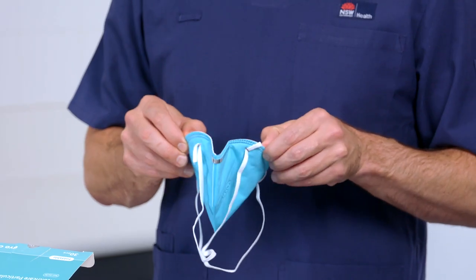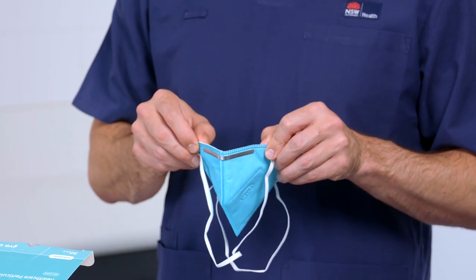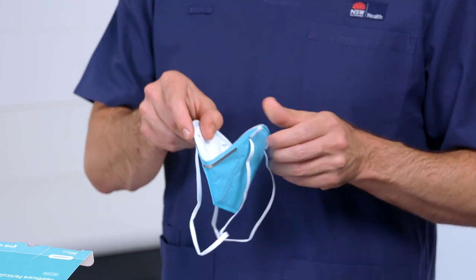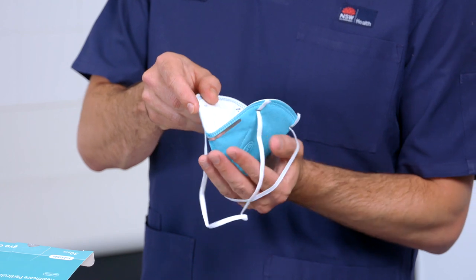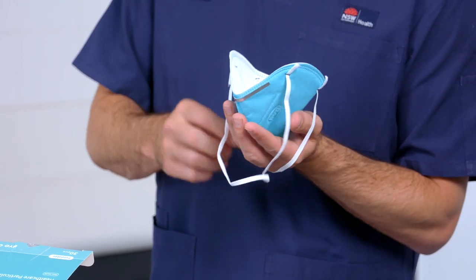Unfold the respirator and hold it with both hands with the metallic strip facing up. Fully open both panels of the respirator to form a cup shape with straps hanging below the hand.